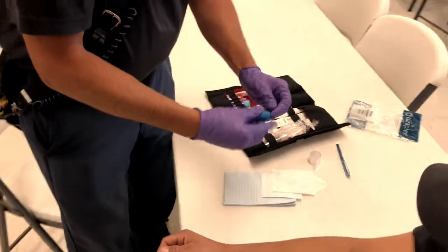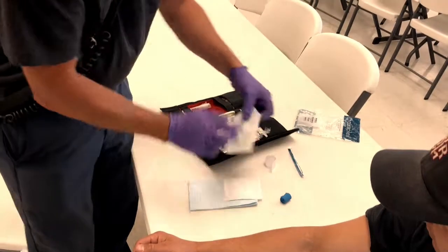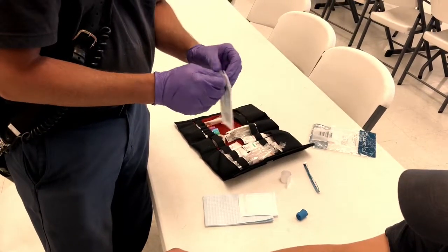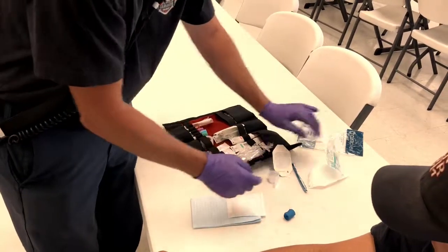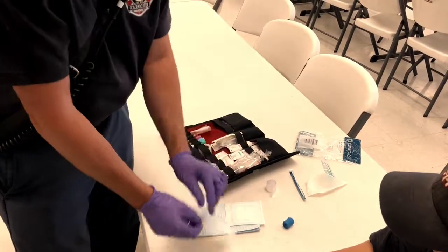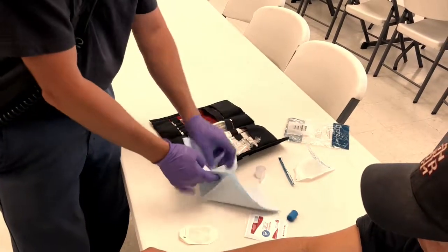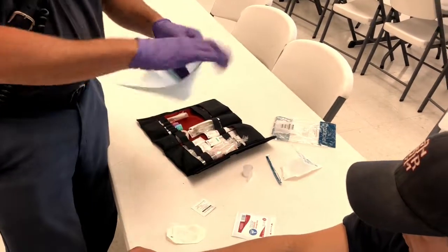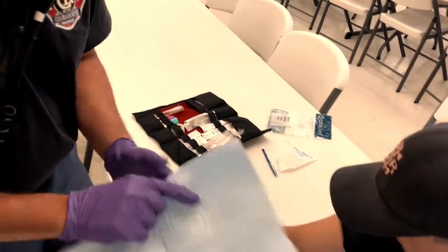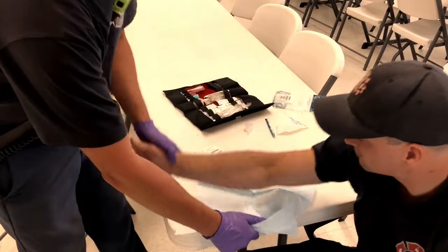We have our tourniquet. We have our Tegaderm. Our 2x2 if we need it, and our towel. And our alcohol. Again, we've identified a good arm.